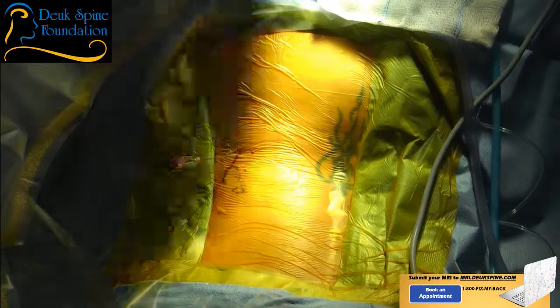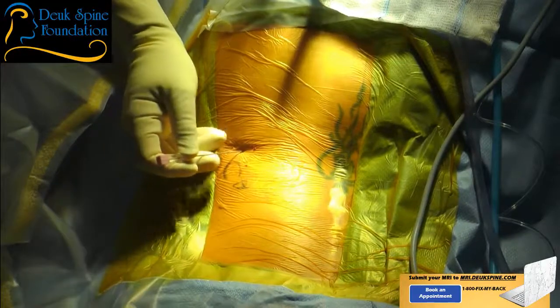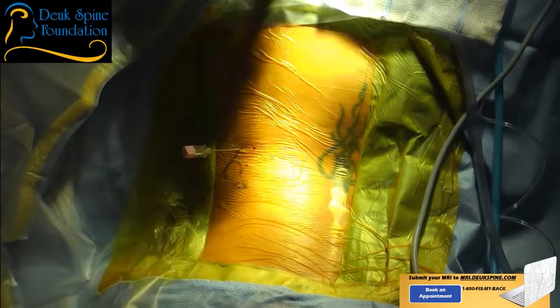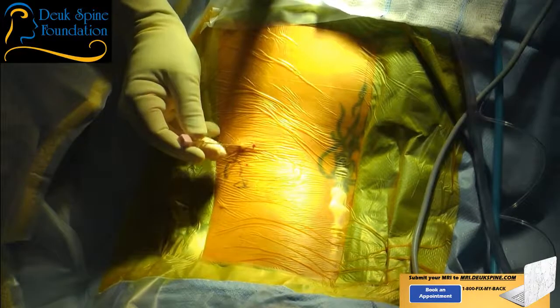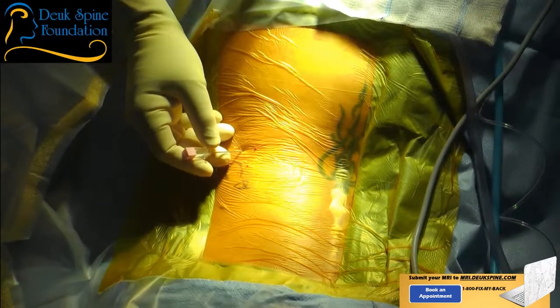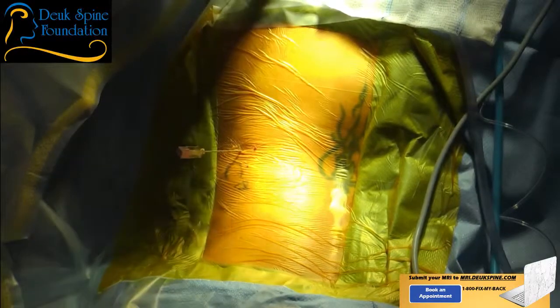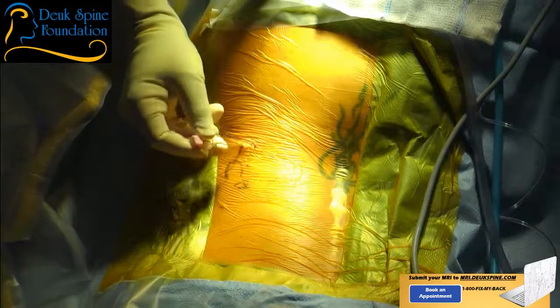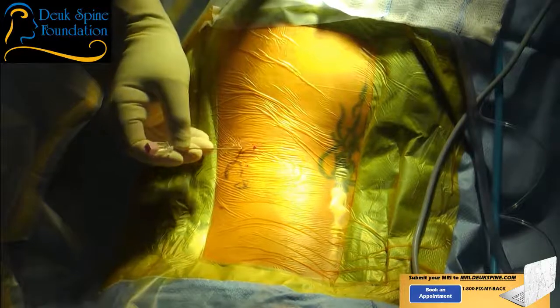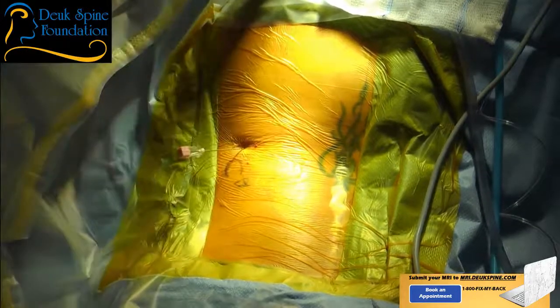Shot. Once again, L5-S1 is the most challenging level. Shot. Right on the facet. You're using a pulse mode? Okay. Shot. You're doing really good.